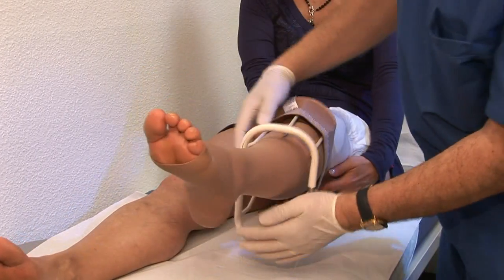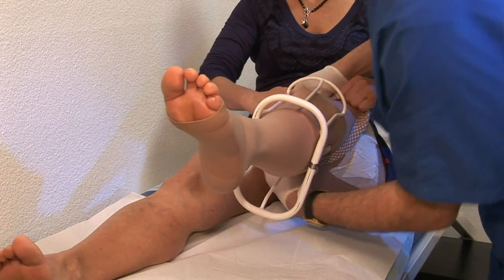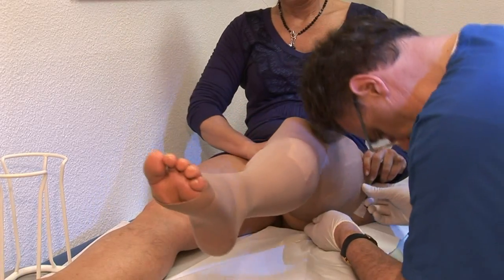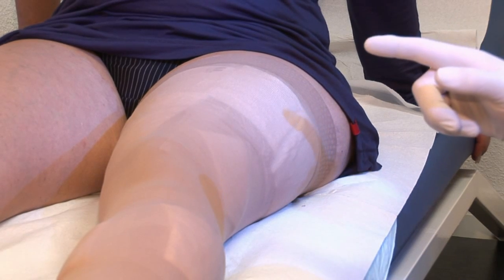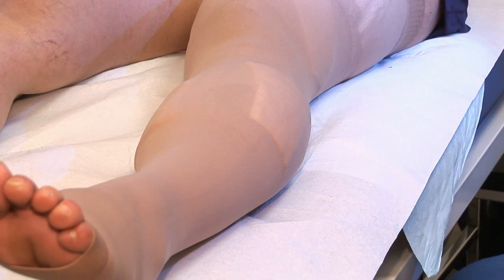The patient usually wears this compression continuously for 24 hours, that is, also at night. The local compression is then removed. The compression stocking should then be worn for about 8 hours during the day, for at least 2 to 7 days. The compression prevents excessive microthrombus formation and hence also hyperpigmentation.